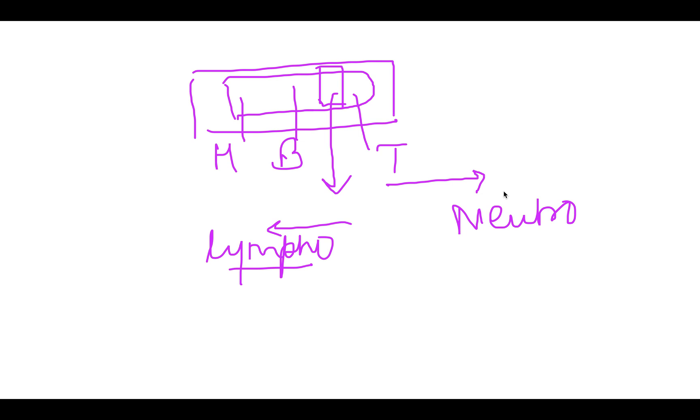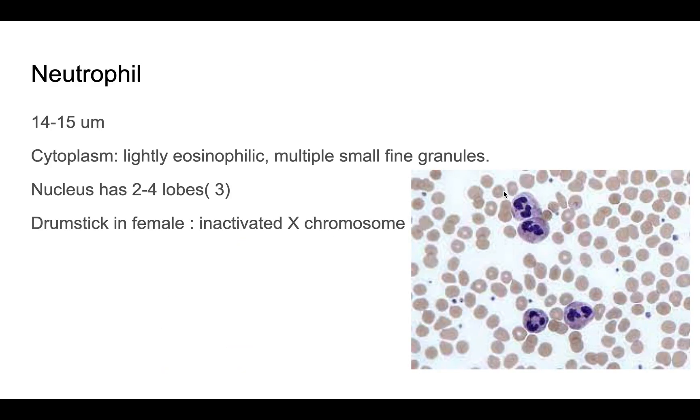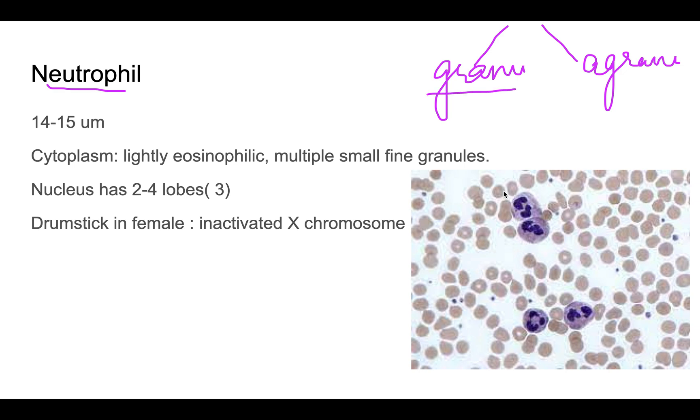The smear is examined under 40x magnification. WBCs are divided into granulocytes and agranulocytes. Granulocytes have cytoplasmic granules and include neutrophils, eosinophils, and basophils. Agranulocytes do not have granules and include lymphocytes and monocytes.